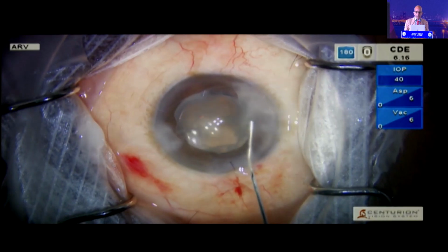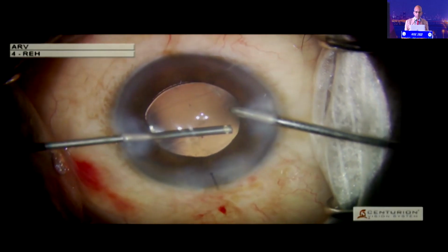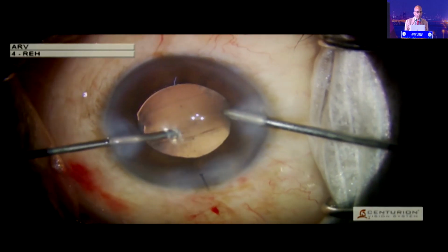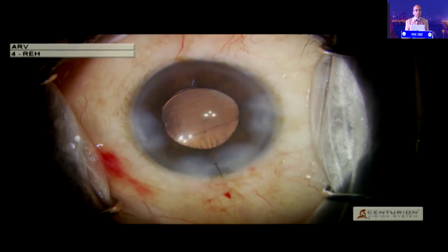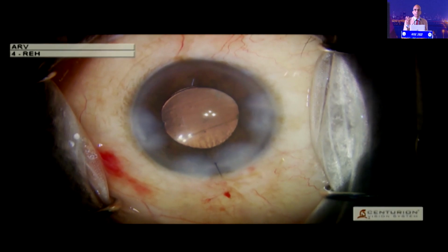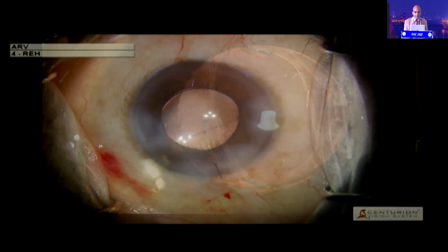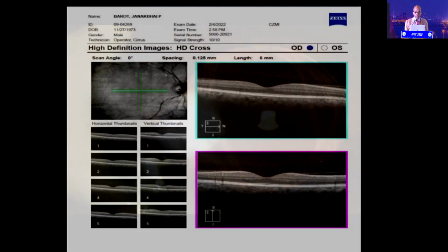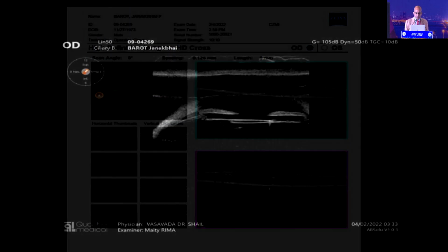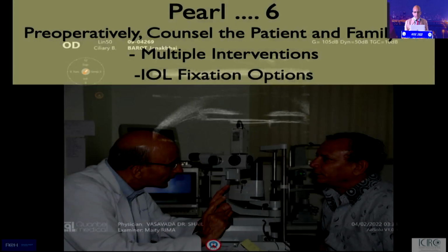at the end of the surgery, I've taken out the suture, the main incision, to make sure: is there any vitreous? Well, I didn't have any vitreous, but I had kept the vitrector open in anticipation. I didn't have to use it. So this was an opportunity for me to use it to aspirate the viscoelastic. There was no vitreous. Just because I had the vitrectomy opened up, I had to justify its use. This is what it looked like later on down the line, post-operatively, and monitor the peripheral retina and so on, and monitor the stability, whatever imaging you have.